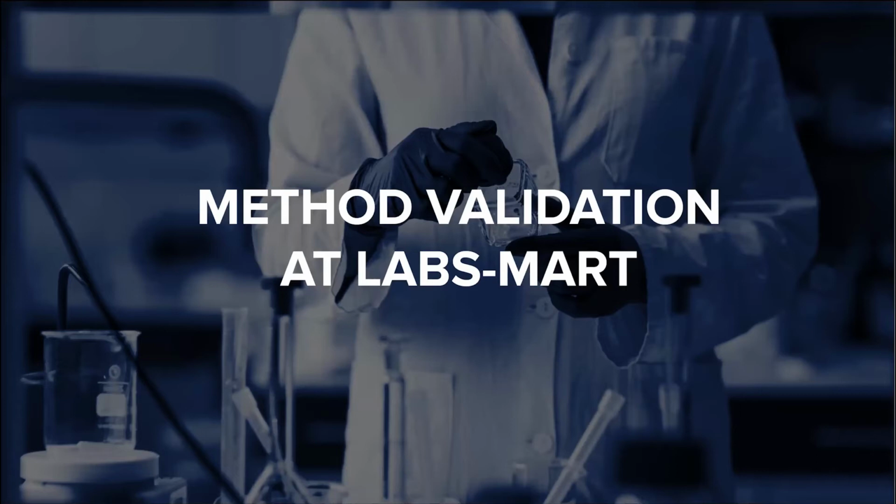In the next section, I will detail the experiments we employ here at Labs-Mart as part of our method validations. However, before getting into the validation experiments, I'd like to speak briefly about what we call pre-validation. During method development, the main objective is to optimize the analytical method to detect or quantitate specific analytes or analyte of interest.